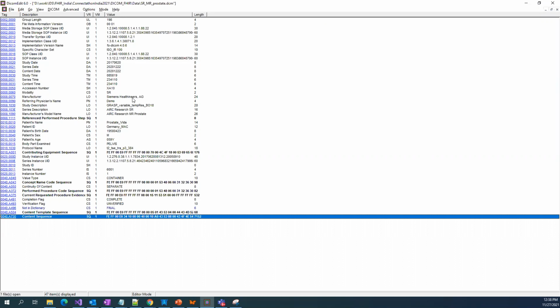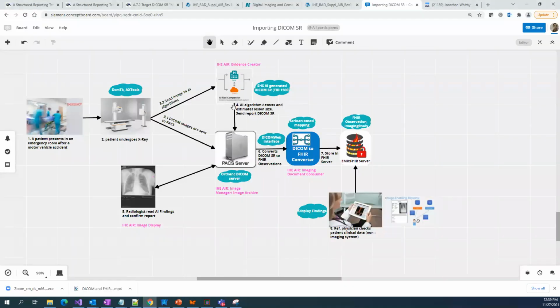So all the sessions that were done yesterday, for example, Orthanc and all that, is just for getting a context, right? Yes, we want to go top down. No, Orthanc we'll be using as well. It is not only getting the context. You should be using that. See here, all these DICOM SRs, we'll be storing it here.